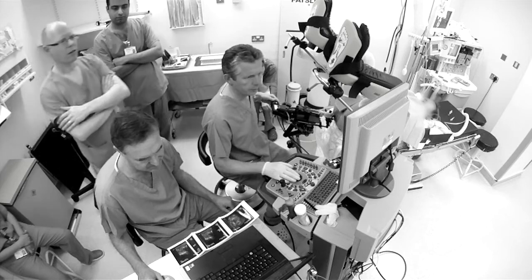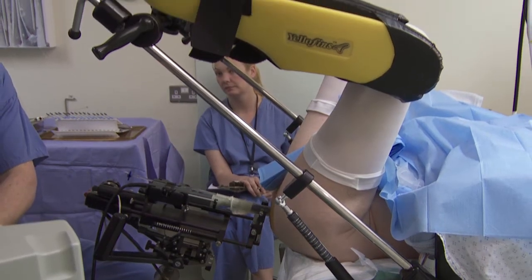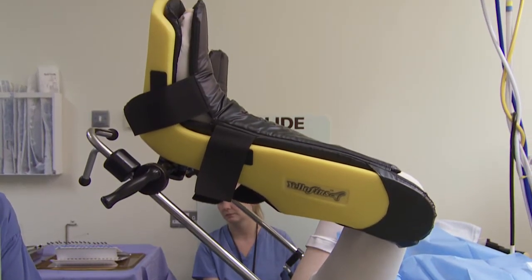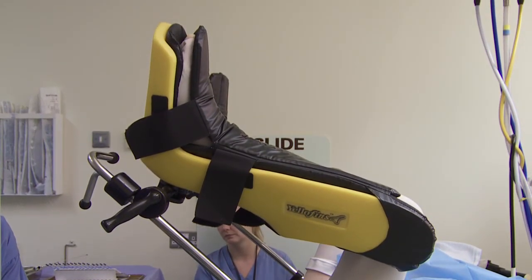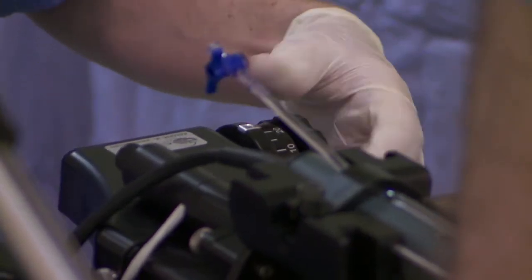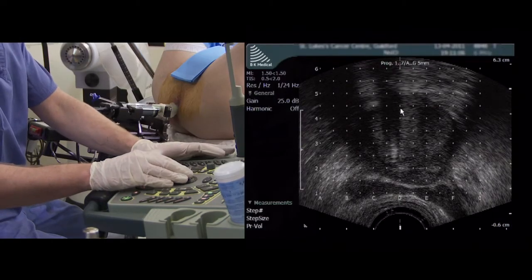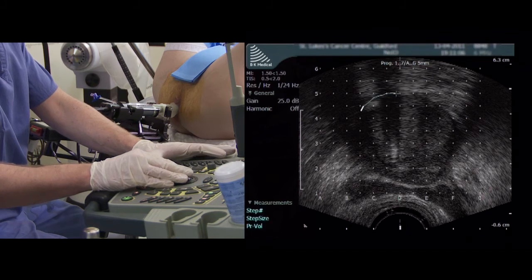We're just about to start this case. The patient's anaesthetised, they're lying symmetrically on the bed, the ultrasound probe is in the rectum, we've lined the whole case up and we're ready to start the implant. With everything lying correctly, a detailed intraoperative planning scan of the prostate is performed for the first time and saved to the dose planning computer.